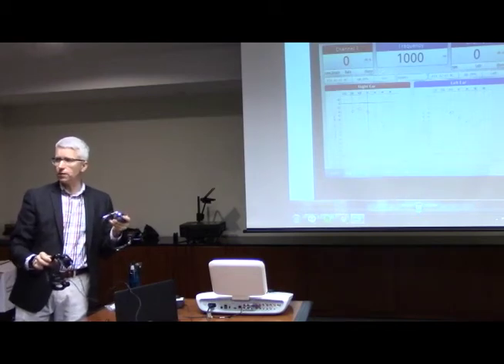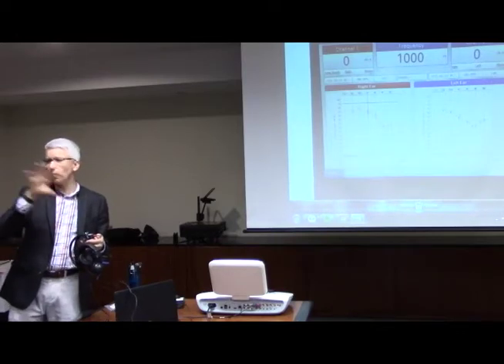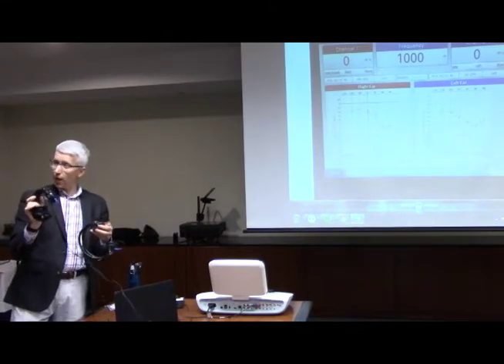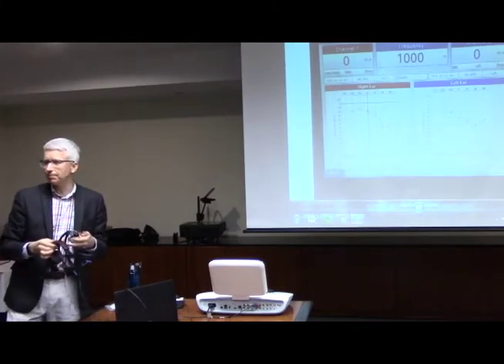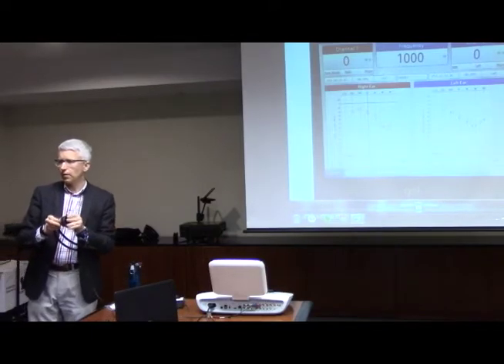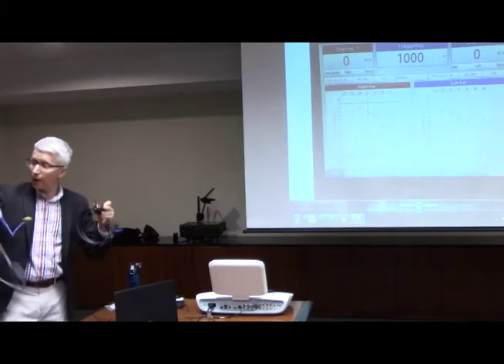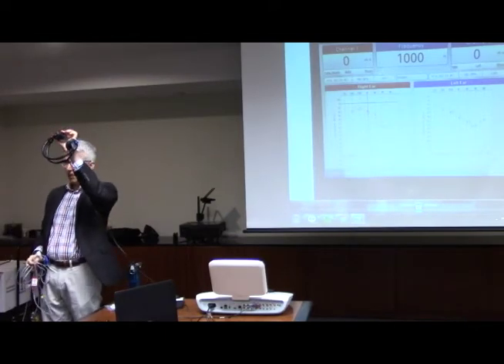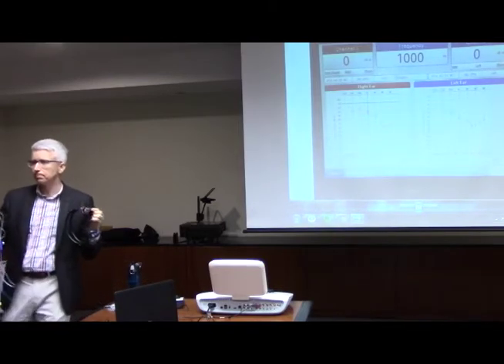Okay, so even though that was already calibrated 2 weeks ago? Right, because we changed what it is. There's a whole bunch of data inside, and the data that's in here tells it how loud to present so that it's presented the right amount. But there's only one data table, basically. So once we overwrite that, we'd have to redo it again. It doesn't recognize that you may have two different sets of transducers you're going to use off that one audiometer. It says, this one I've got to pump out this much to get 40, this one I've got to pump out a different amount. Unless you're using two separate transducers. So if I had these plugged in and these plugged in and they're both calibrated, then by just pushing a button, it's going to know. But these all plug into the same place, so it needs to know, when something's plugged into that port, how loud it needs to be.